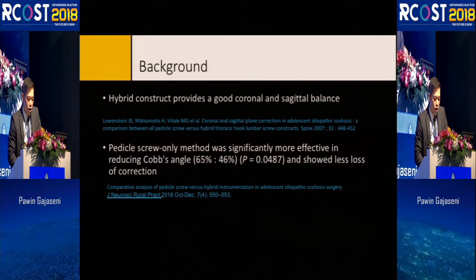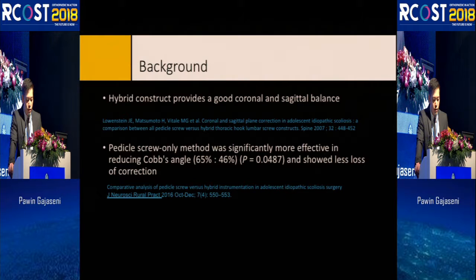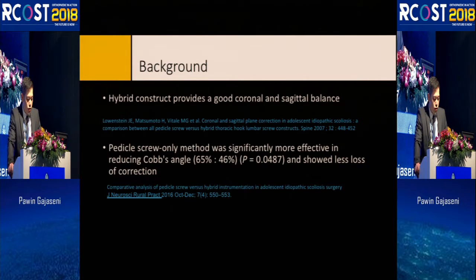Many papers try to compare the results of treatment between the hybrid and the PDS, but the results are still controversial. The hybrid system allows deformity correction in the coronal, sagittal, and axial planes, but in terms of degree of correction, there is no consensus on which method provides the best correction. One paper compared the pedicle screw and the hybrid system, and showed that the degree of correction of the pedicle screw alone is around 65% compared with 46% for the hybrid construct.